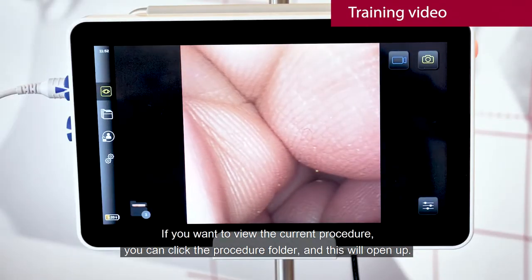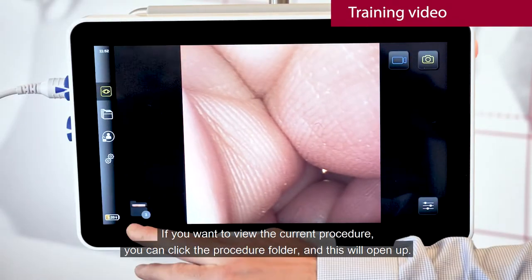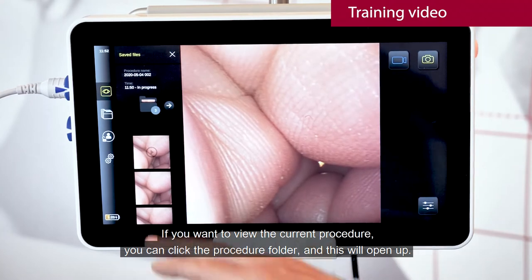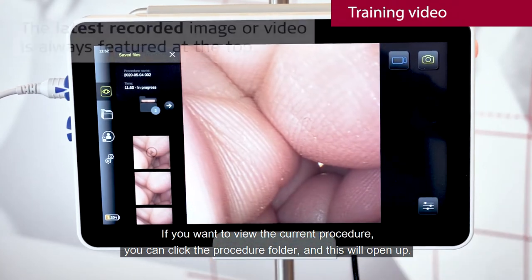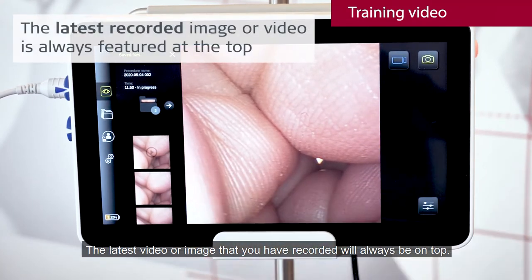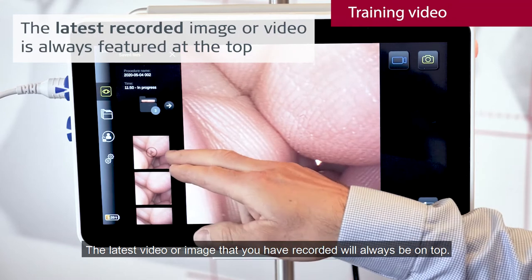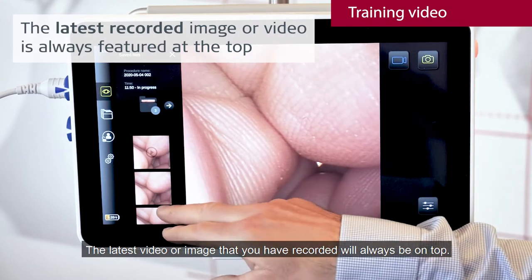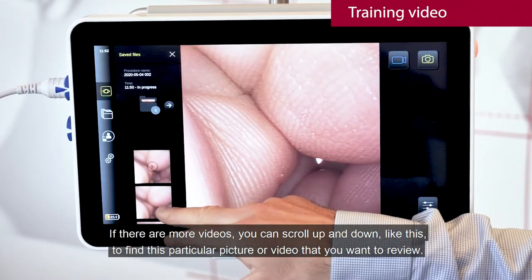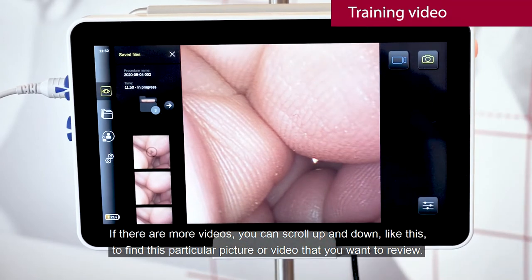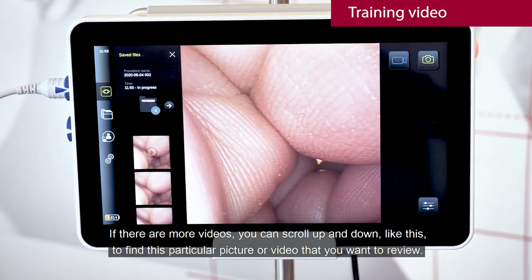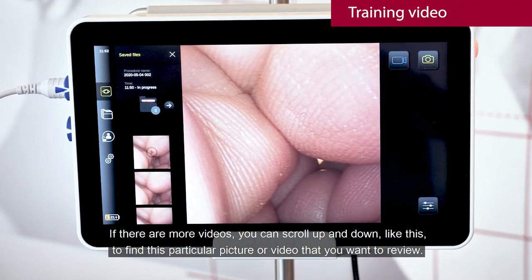If you want to view the current procedure, you can click the procedure folder and this will open up. The latest image or video that you have recorded will always be on top. If there are more videos you can scroll up and down like this to find the particular picture or video that you want to review.